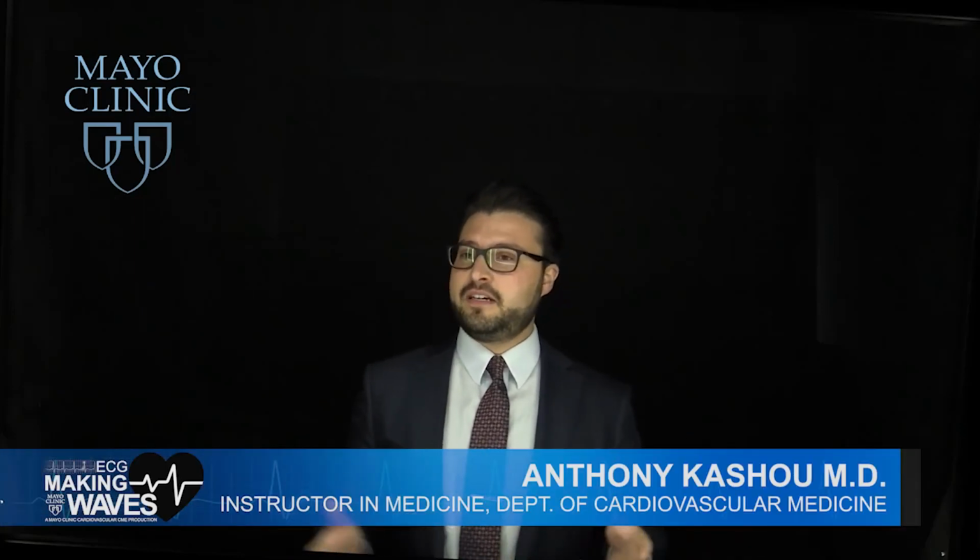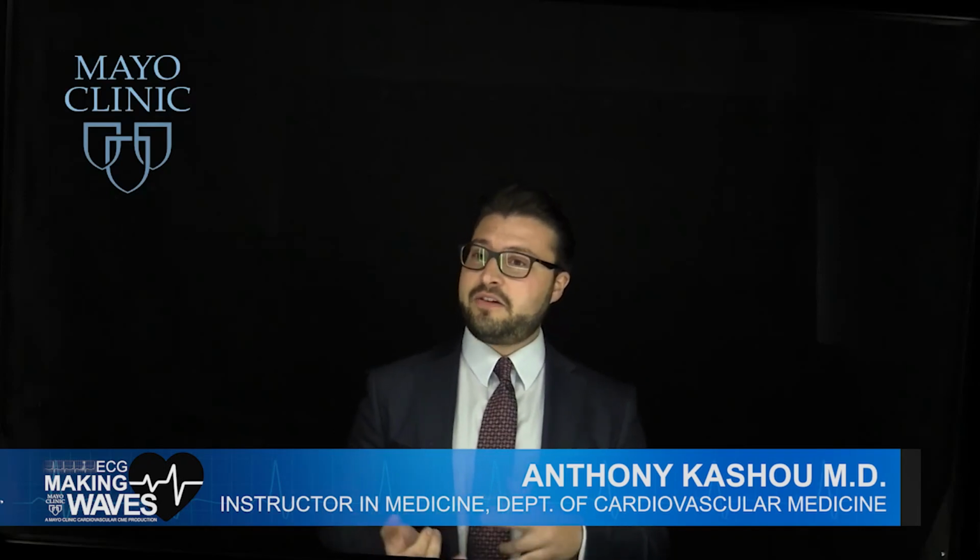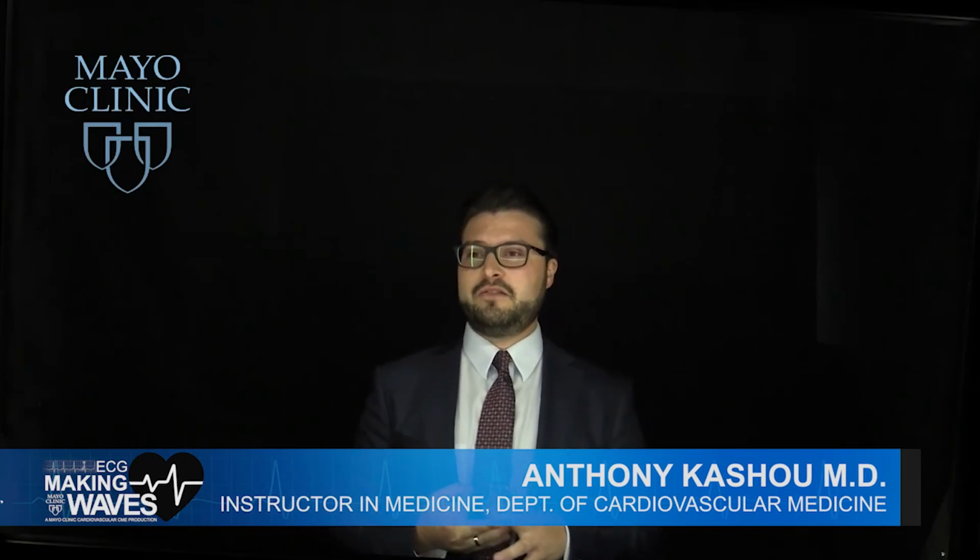Well, Dr. Mayo, if I were shown this as a medical student, or early in residency, and I saw a regular, fast, wide rhythm, you just think of VT. Right. And so I guess it's the first thing, knowing that it could be something else too. And not only that, your management completely changes.